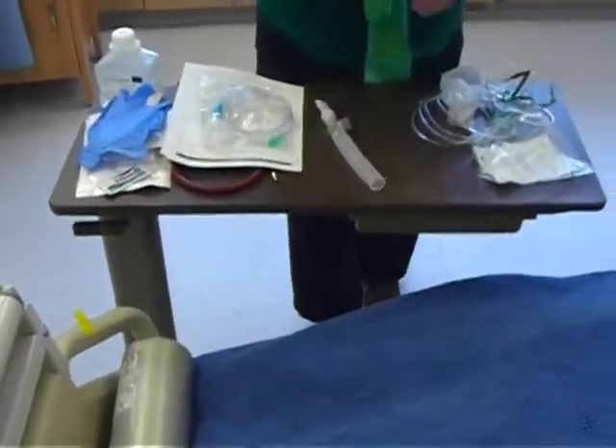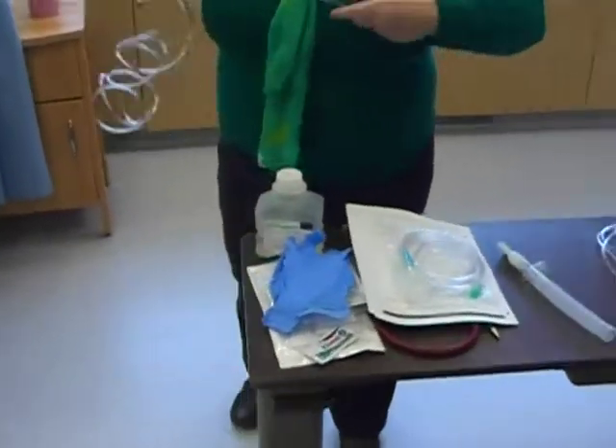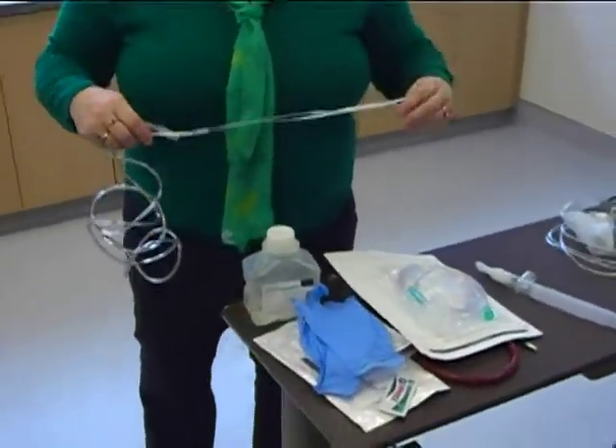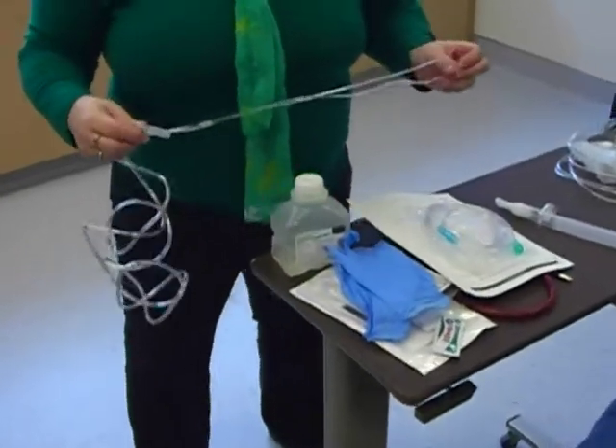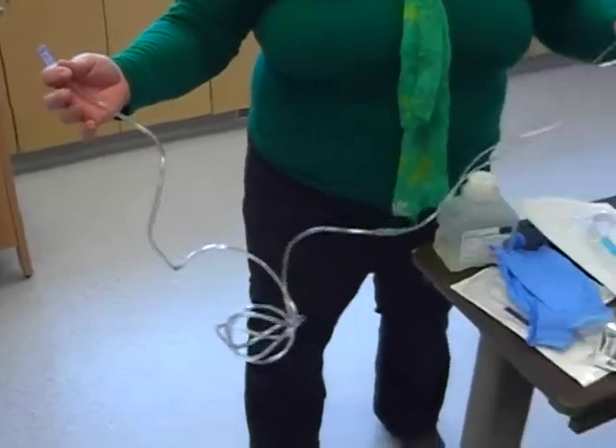Hello guys, I'm back again. This video, excuse me, it is a different week though. We're going to learn all about oxygen and how to connect a patient up to various types of oxygen.